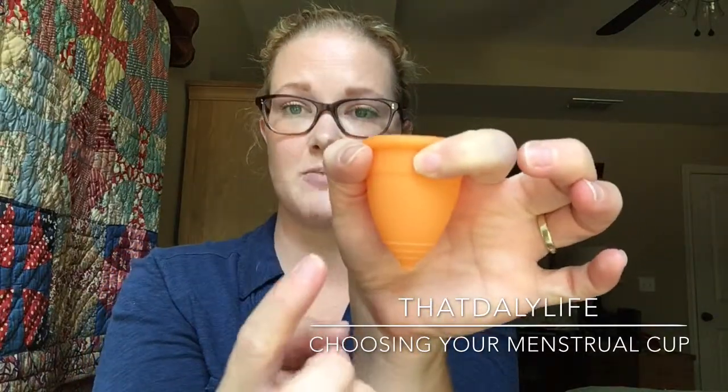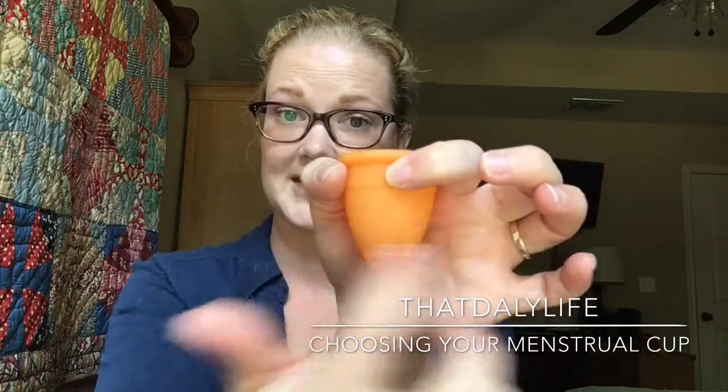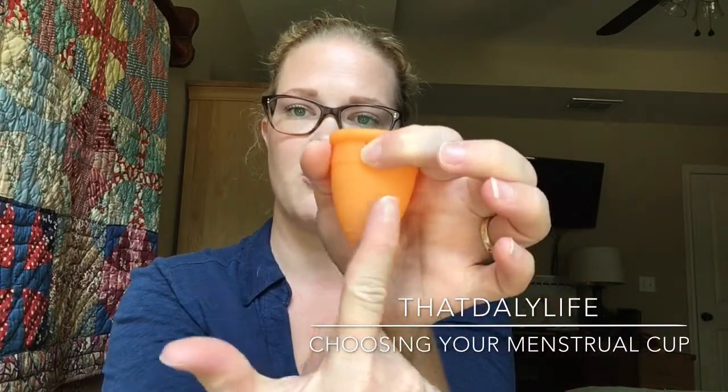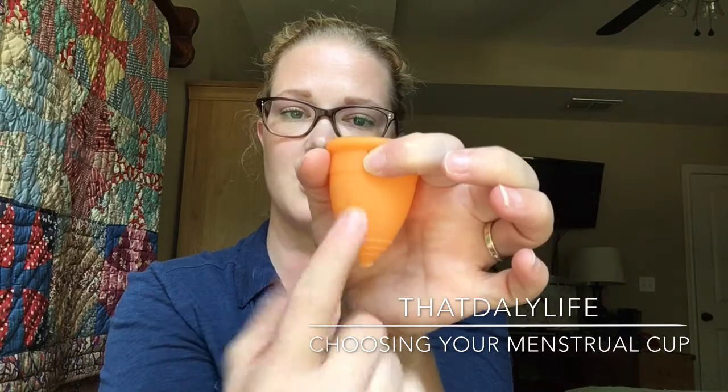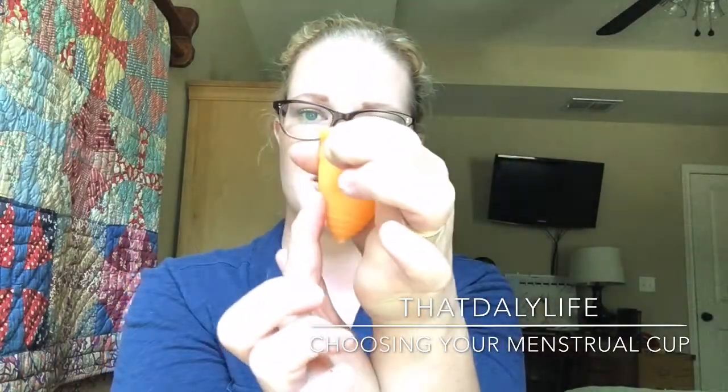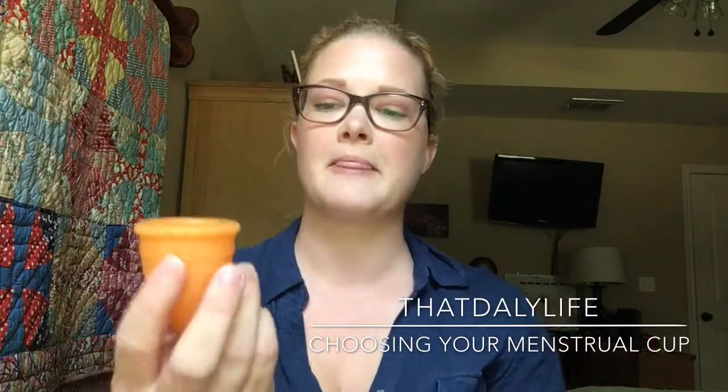To determine whether or not it's popped open, which would seal it so that you're not going to have any leaks, you're going to lightly insert a finger and run it around the edge to make sure it's smooth. If it's not inserted all the way, when you run your finger, you'll feel, oh, there's a divot right there. It's not popped out. And then you can remove it and try again.